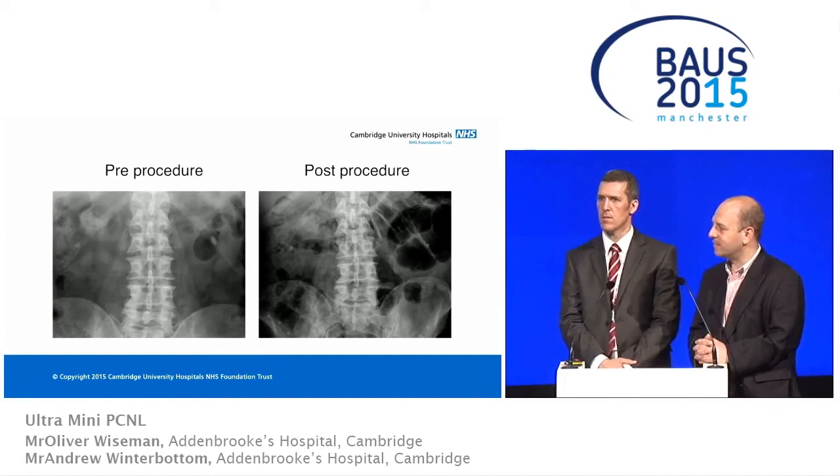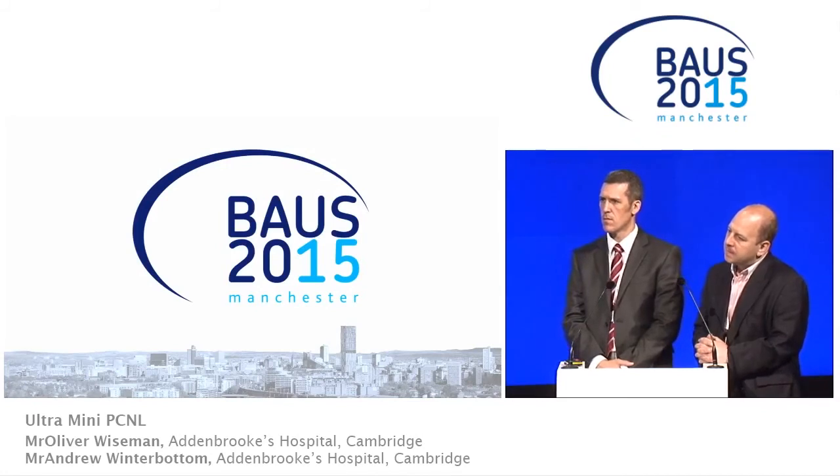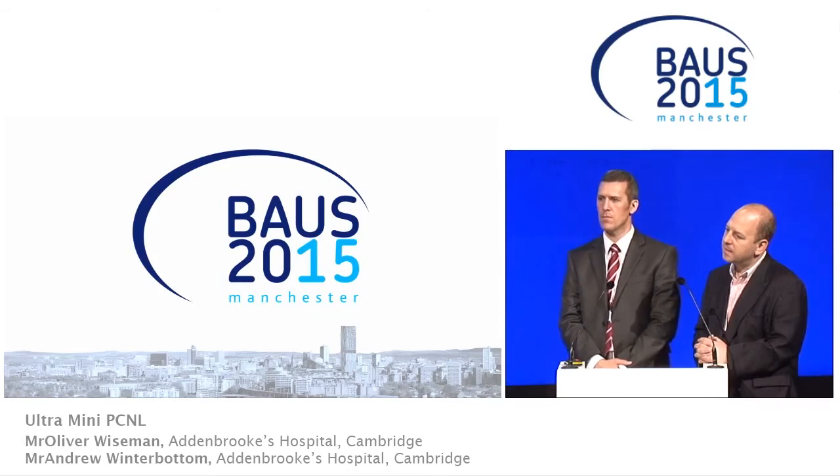Thanks, Sam. Microphone 1. This is more of a comment. With the 16 to 17 French mini PCNL, addressing the comment about worrying that fragments will go elsewhere in the kidney, I've worked out how to remove the sheath, and then you can pass a flexible cystoscope through the tissue and have a look around the kidney. If need be, you can put the rigid scope back, or you can manipulate a fragment back into the renal pelvis. Okay, thank you.